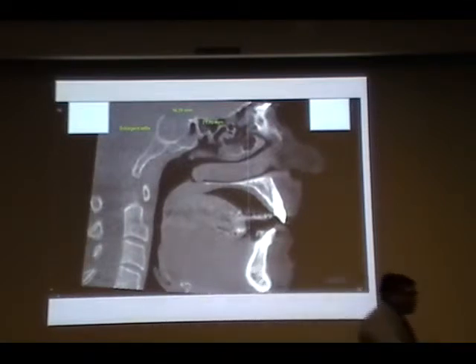That's the inferior turbinate, that's what you're saying. So this is the middle turbinate. Good job. What I want you to focus on is this particular portion here. So what structure is that? It starts with the letter P.